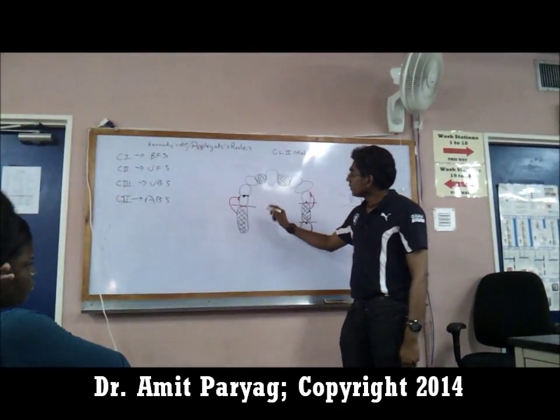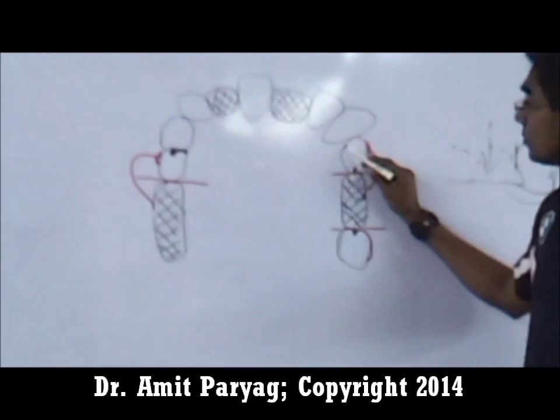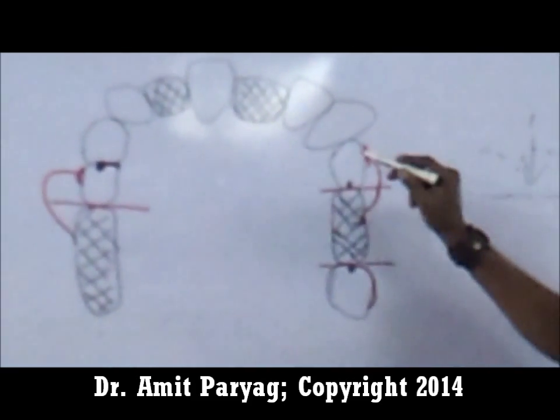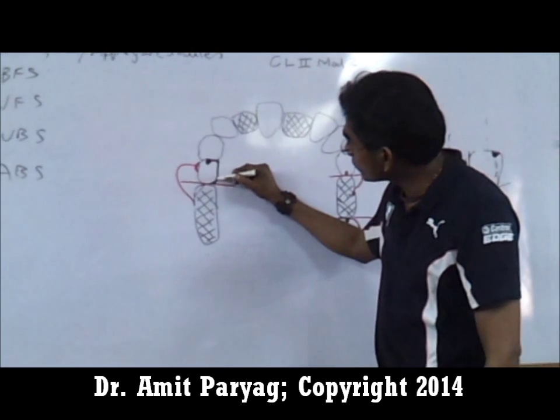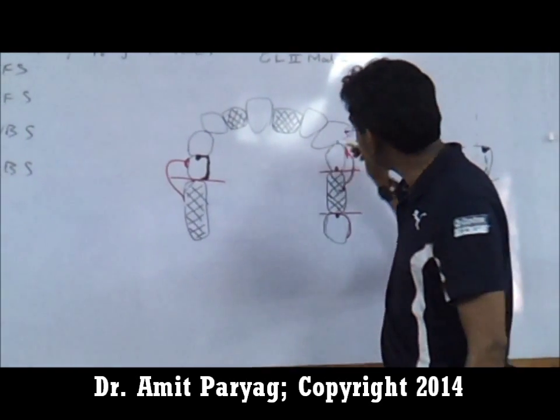For these teeth, if there are undercuts on this side, I do not put a clasp arm. If I had used a C-clasp here, yes, I would probably put a C-clasp arm. But for these situations, what I do is allow the metal to flow all the way up the side of the tooth as a plate.